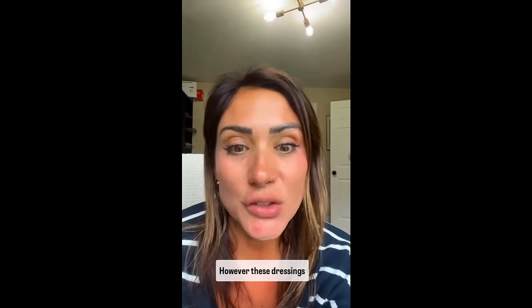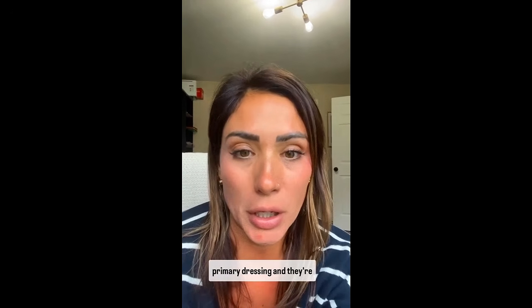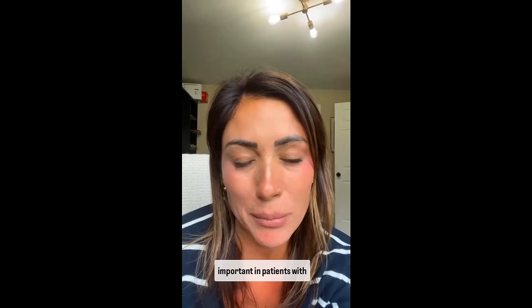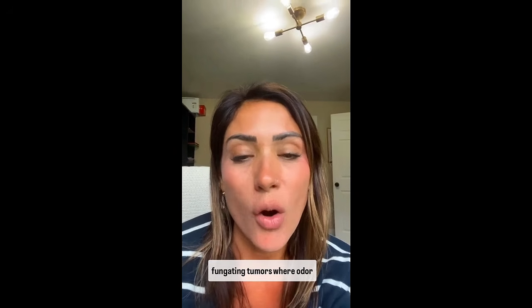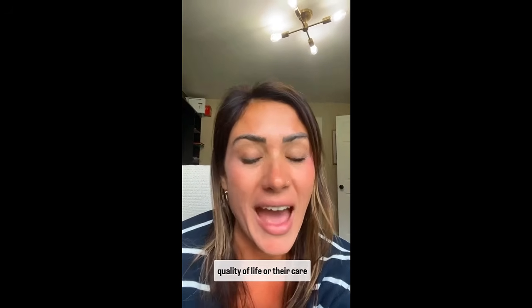However, these dressings are always used as a secondary dressing. They're not going to be a primary dressing, and they're used to mitigate the smells that wounds can have. This is particularly important in patients with oncological wounds, such as fungating tumors, where odor can be significantly impacting the patient's quality of life or their care team and causing some distress.